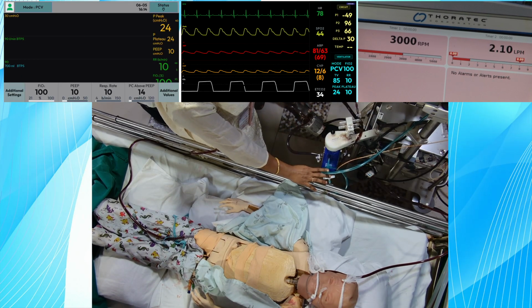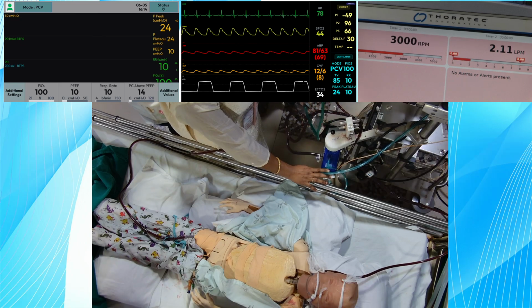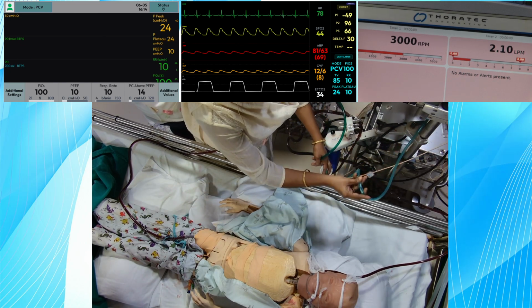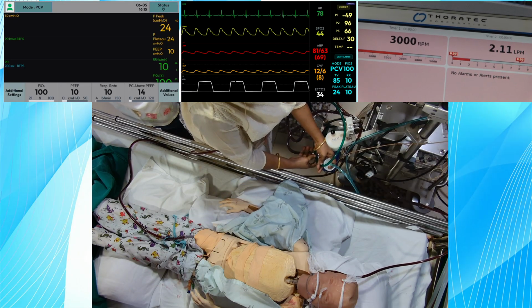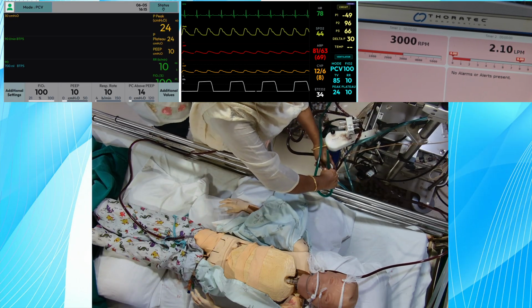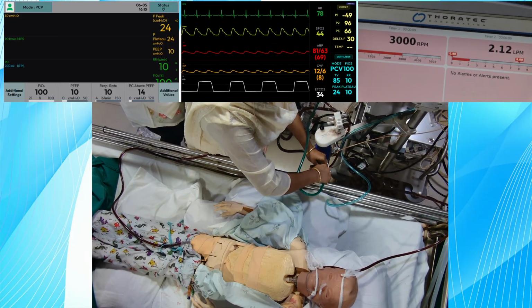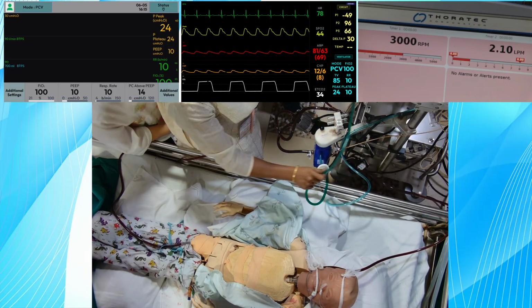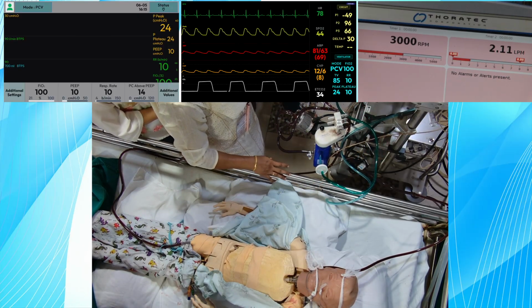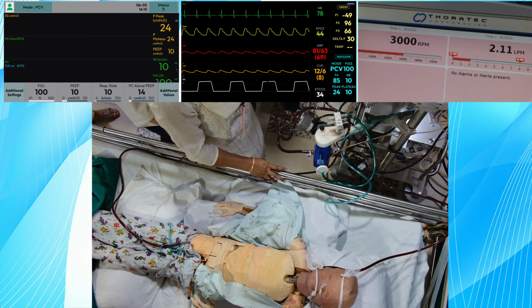What's in between the blender and the oxygenator? If the color is the same, it is recirculation. Recirculation. We have changed the tubing. So nothing is working. Sir, we have changed the tubing, isn't it?